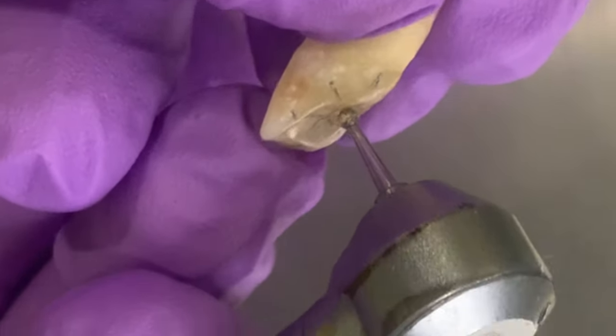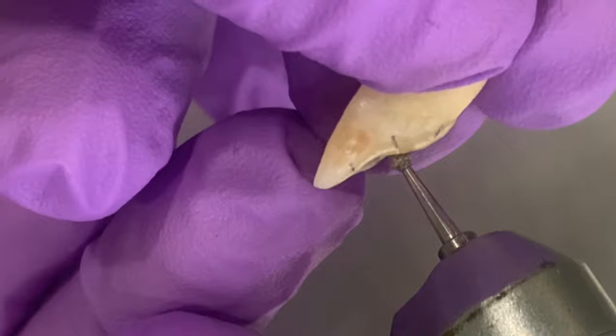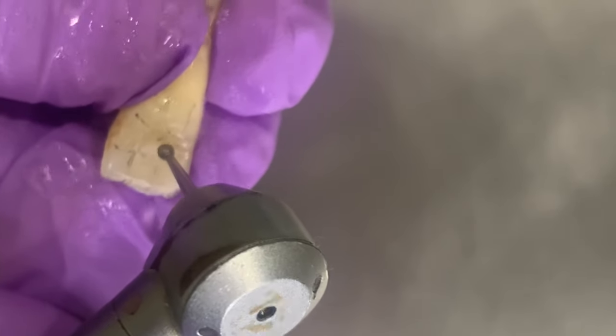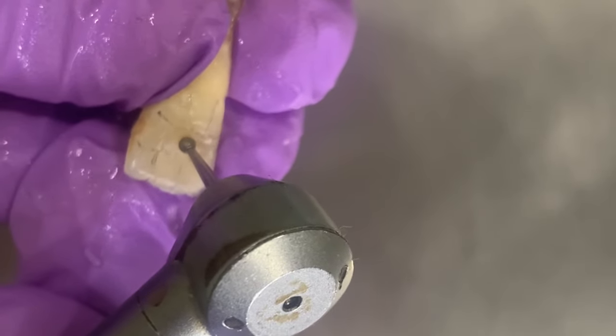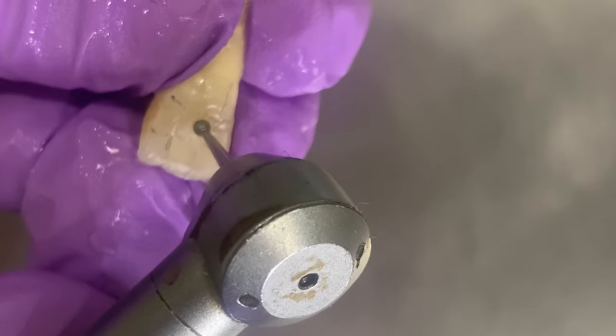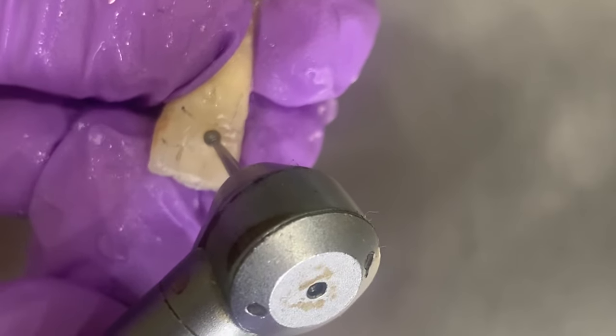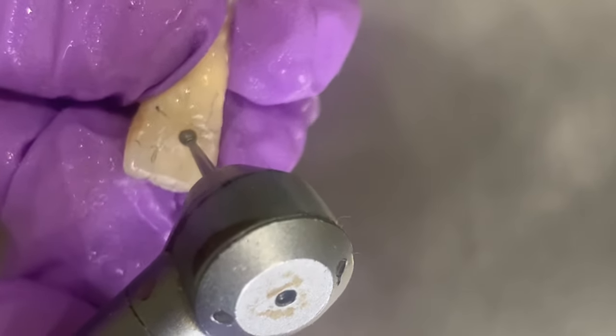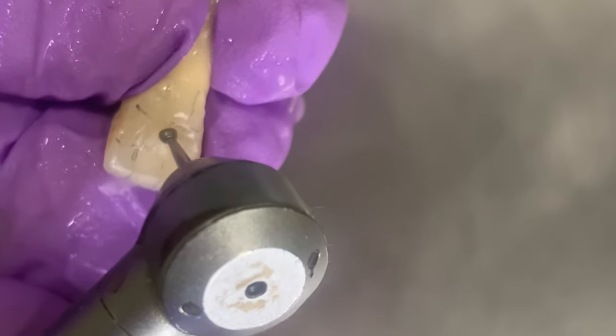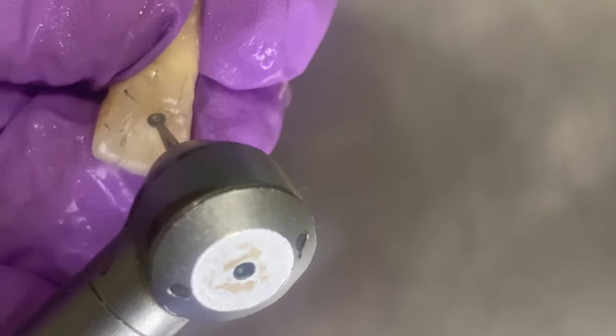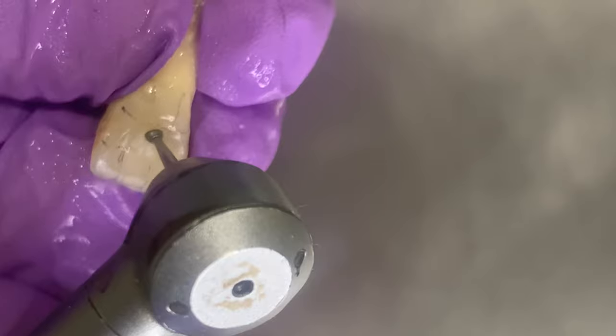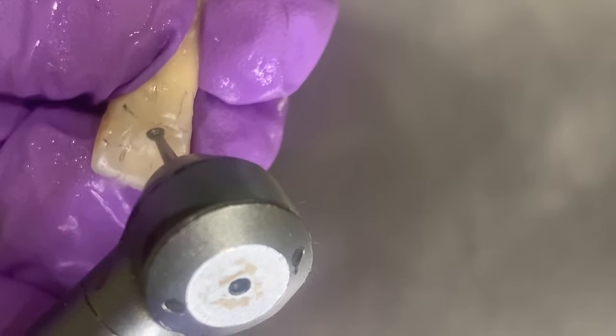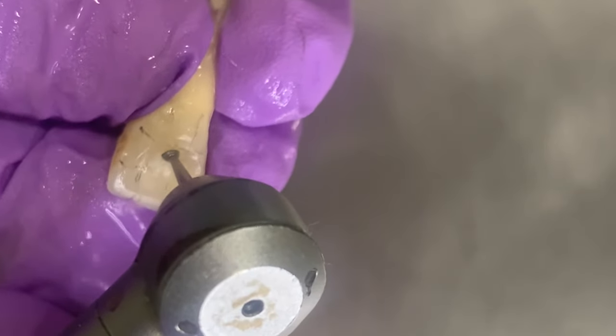We penetrate the enamel with a round bur. We have made a notch in the enamel.